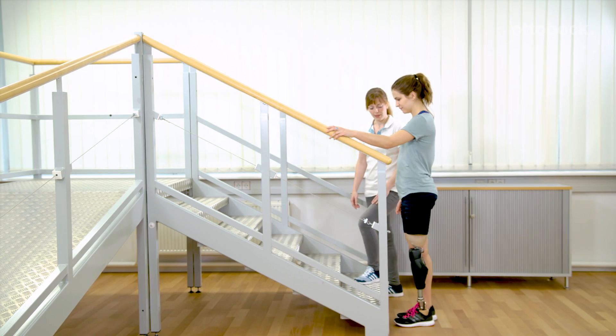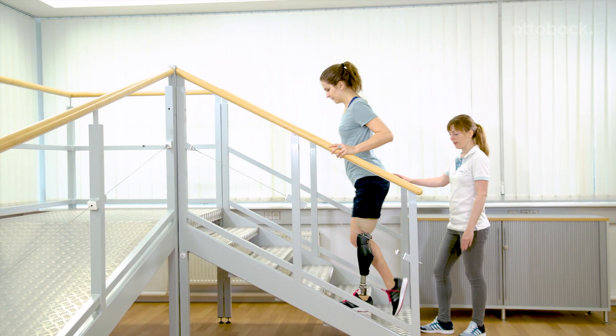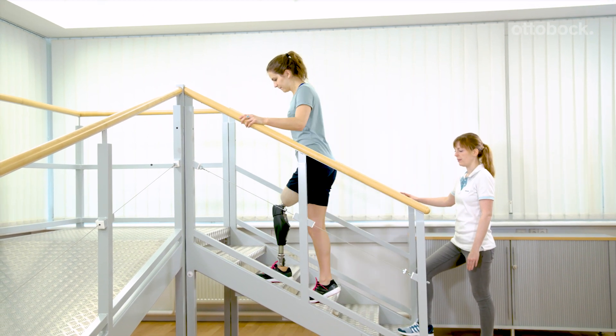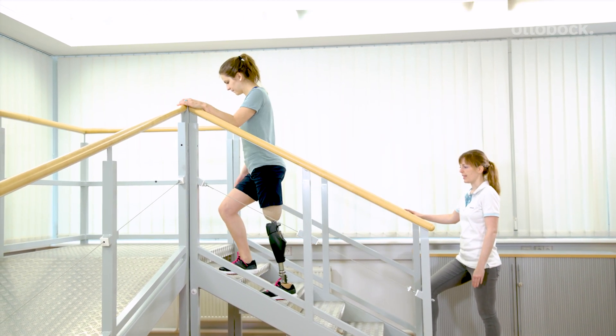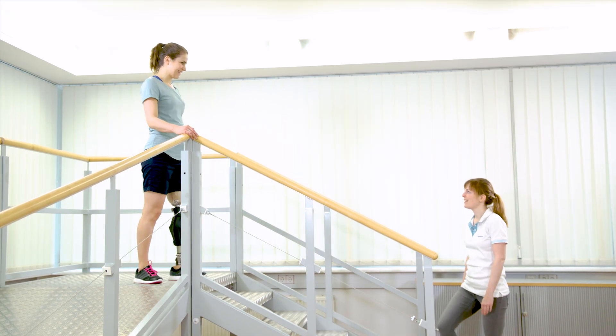During training, change the handrail to impede the exercise and challenge the user. Going upstairs step over step without a handrail is very difficult. It requires very powerful muscles and excellent balance.